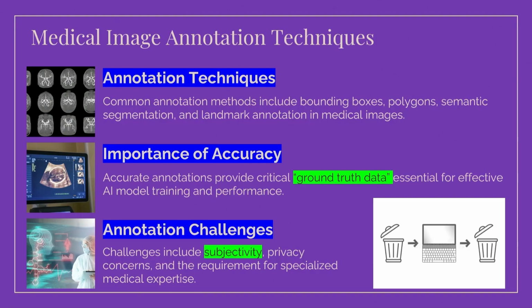So that's what is causing the inconsistency, because someone may consider the lesion this big, but someone else may consider the lesion a little bit smaller than the previous observer, and that causes inconsistency. And if you put in data which is wrong, then you get everything wrong. So what we call garbage in, garbage out for AI models.